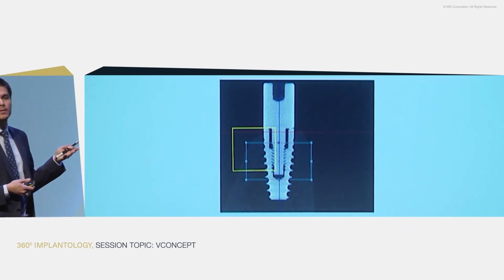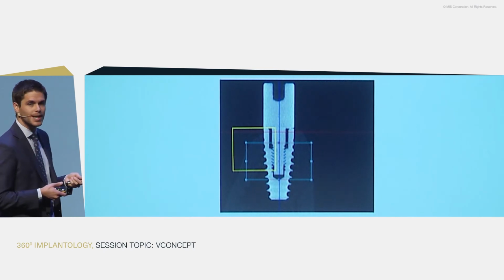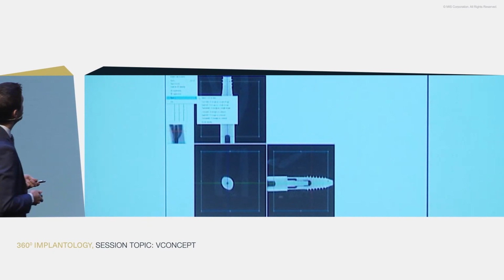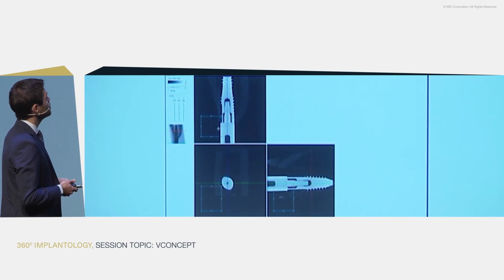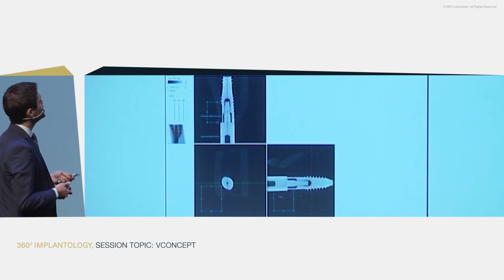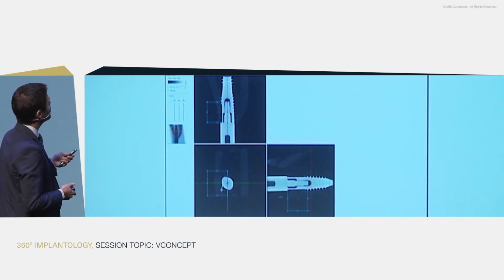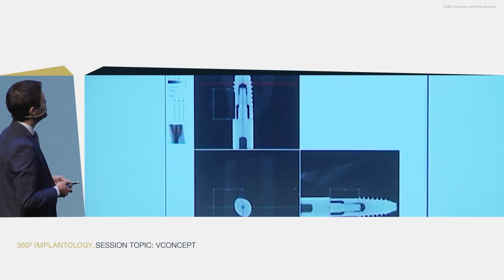So what we did is we selected a smaller region of interest, and that region of interest was focused on the buccal aspect, as you can see here. And once again, allow me to show you the video. And here we're basically, again, selecting a region of interest that's going to be 150 cubic millimeters, that's going to be around the buccal aspect, and we'll center that on the buccal aspect, and we'll have that in the center of the mesiodistal image as well.